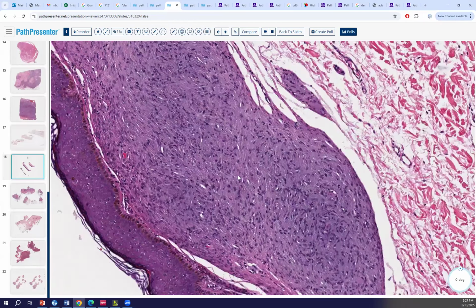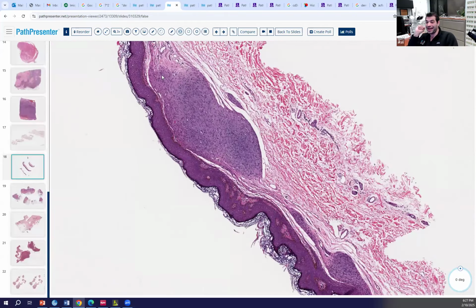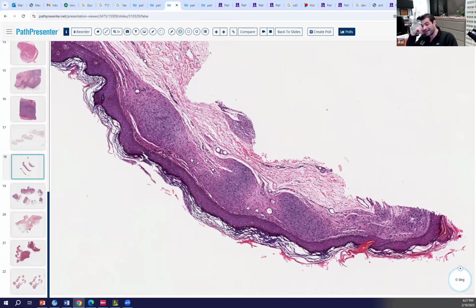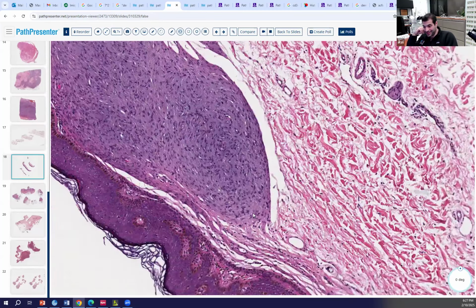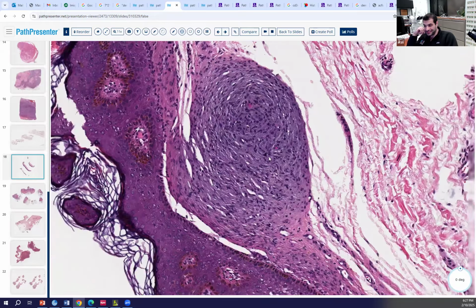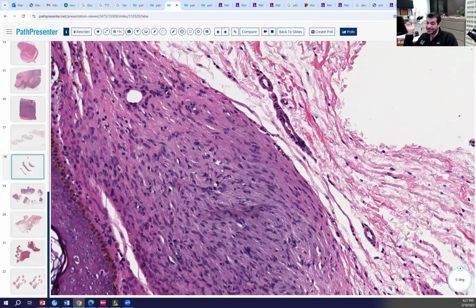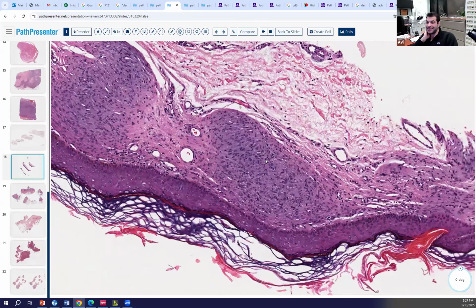That's the sclerosing perineurioma. This is sclerosing perineurioma. So it's similar in the sense that it had like a multifocal type of look to it, almost like a chain-like linkage from one to the next, except the chain wasn't really connecting. It is kind of connecting here, a trabeculated type of growth. Whirling, that's the other thing you look for. See the whirlies? Whirling, whirl. And here. But in this example, it's whirling, it has, as the name implies, a sclerotic type of stroma, organized in chains, and it has a whirling pattern to it.